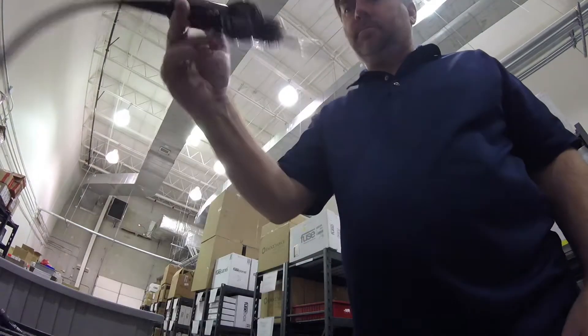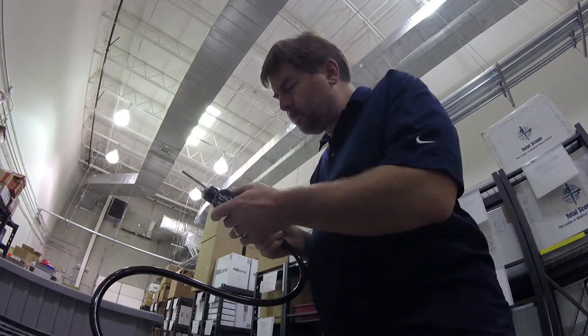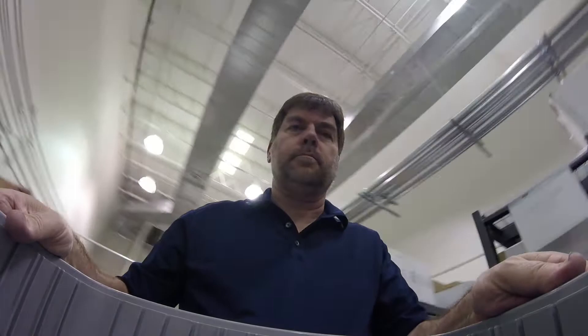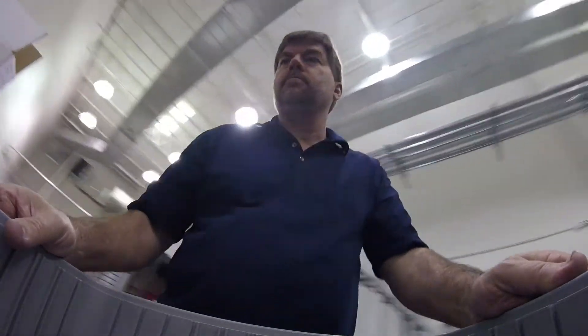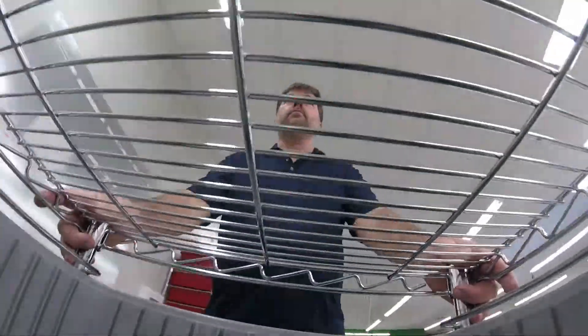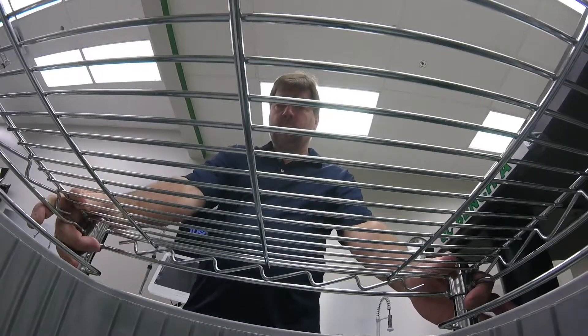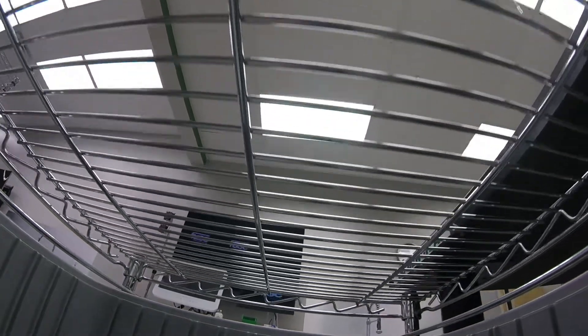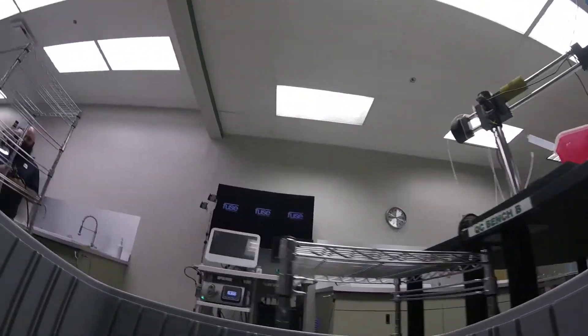We begin our adventure at TotalScope. Upon receiving the endoscope, operations personnel carefully remove the endoscope from the carrying container and place it into a bin. This is how it will be transported for the remainder of its stay here at TotalScope. It's during this process where the scope information is entered into custom programs. Traceability can be established and all inspection and repair paperwork can be stored. Customers have full access to this information through our web portal.